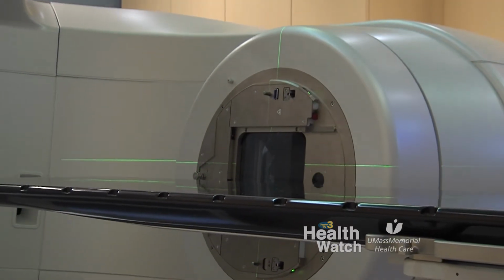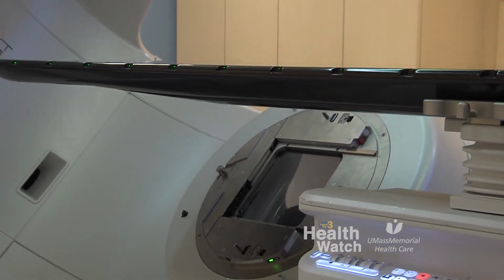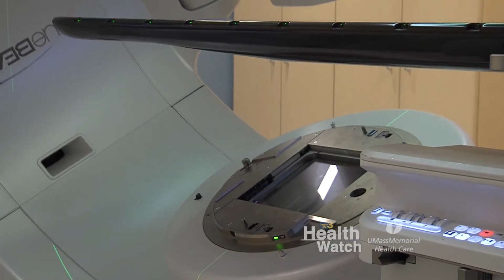What the TrueBeam has embedded in it is the fact that the gantry of the machine can move dynamically at the same time as the motion of the leaves. And this allows for a more rapid treatment. And this is really what limits the amount of time the patient has on the treatment table. So with static intensity modulation treatments, we would actually be treating people over a 25 to 30-minute period of time. This is now compressed to 10 minutes, with the use of the volume modulated arcs. And it's made a big difference in every disease area. The breast patients do not have to breath hold. There are a variety of techniques that permit the use of this technology in every disease site. There are clear advantages.